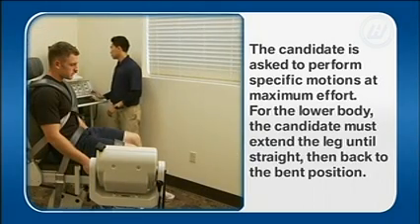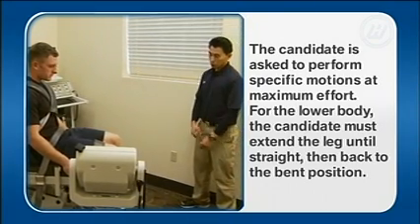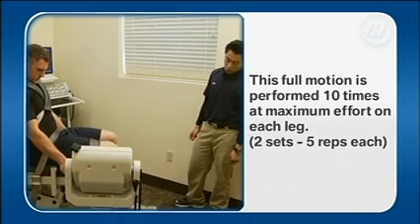The candidate is asked to perform specific motions at maximum effort. For the lower body, the candidate must extend the leg until straight, then back to the bent position. This full motion is performed ten times at maximum effort on each leg.